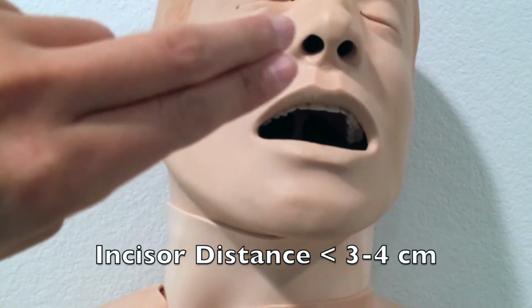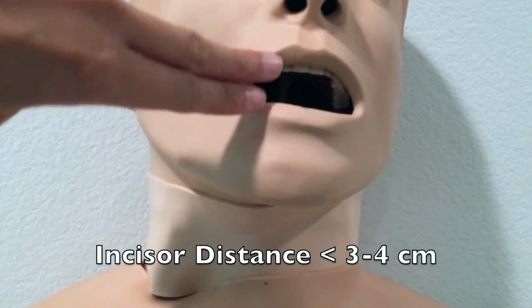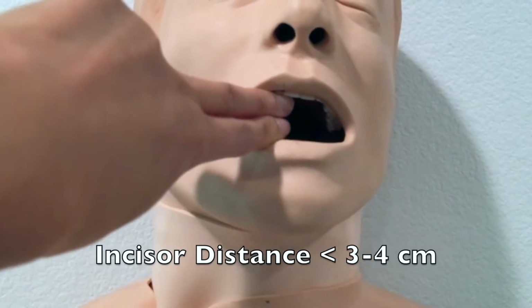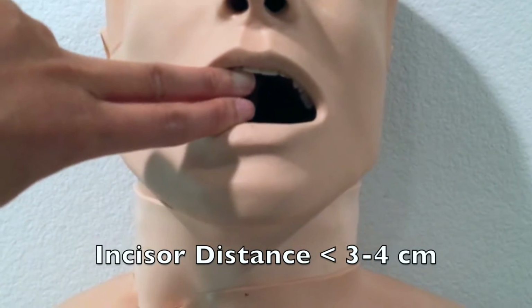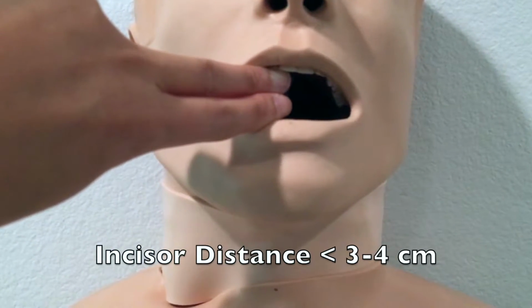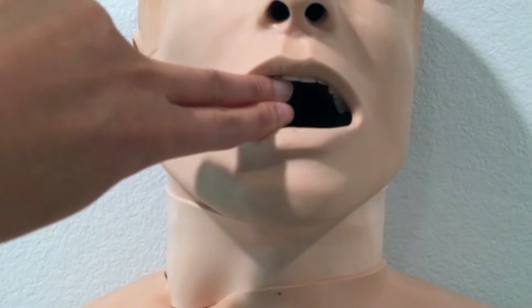I don't recommend putting your fingers in the mouth, but if you can, assess it next to it. But this is a mannequin, so I'm just going to put it in. So you want about 2 finger breadths. If it's less than this, then that's bad. It's about 3 to 4 centimeters. So less than 3 or 4 centimeters is bad.